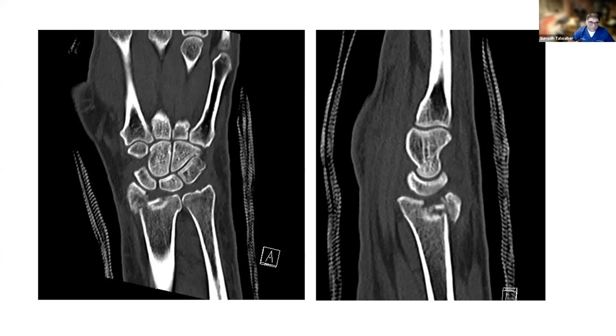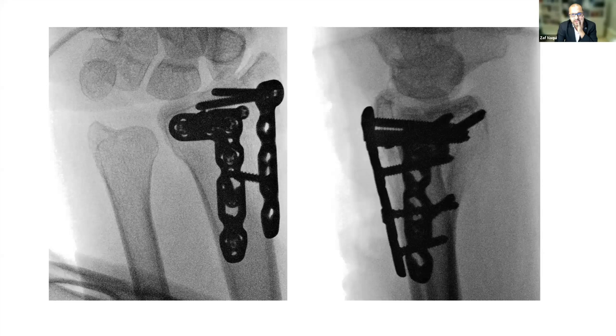Yeah. Okay. Lisa, do you want to add anything here? No, I think, and we didn't conspire, that's exactly right. You can't see the fracture from the front unless you break the volar cortex, which is crazy. And on the back, you're going to get a fantastic view of the joint surface, and you can often see the actual intra-articular surface as well, but you do have to take the metalwork off and you do have to be careful with the extensors.